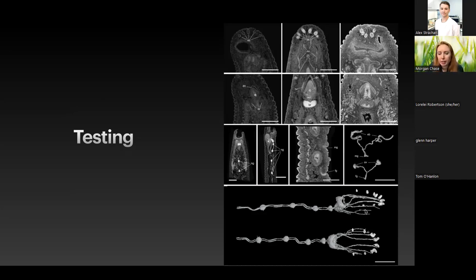I think the smaller diagram of the segmentation are the reproductive anatomy. So on the bottom, the ovaries. And yeah, so I was really surprised at the way that this turned out. I mean, we didn't know how small a feature we would be able to identify with these stains, how much it would change the anatomy, how much it would change the shapes and the sizes of things. And ultimately, we did get some shrinkage of the specimen itself, but that didn't seem, while it did obviously change maybe a little bit of orientation of some of the organs and the features. Ultimately, all the information was exactly, roughly where it should be, which means we can learn even more about the general anatomy.